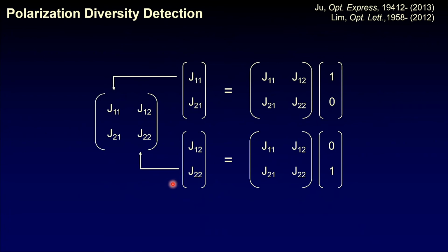The trick of the Jones matrix OCT is that we do this measurement in a time sequence manner, typically 4 times, with a time spacing of something like 10 to 20 milliseconds. And we have a time sequence. By applying time sequential analysis, we can also obtain, for example, flow information. I've already talked about it.